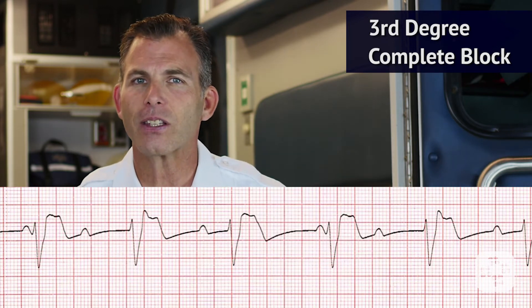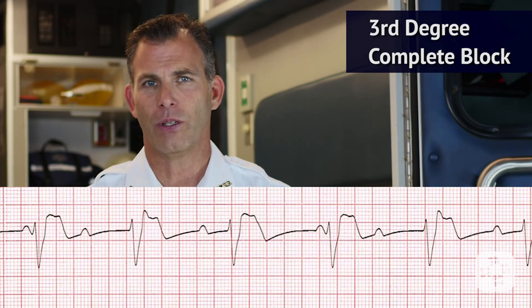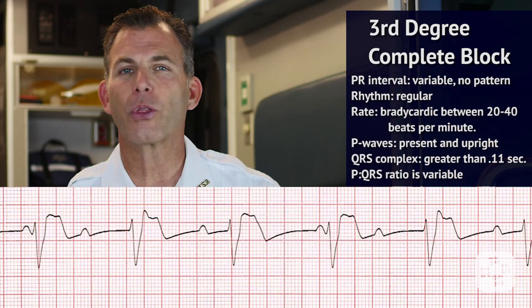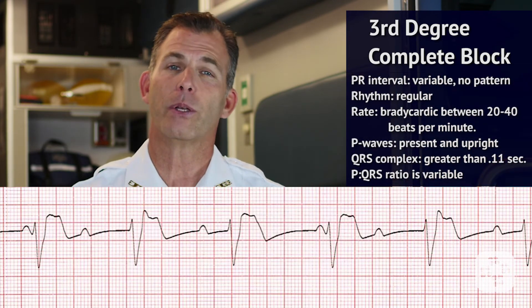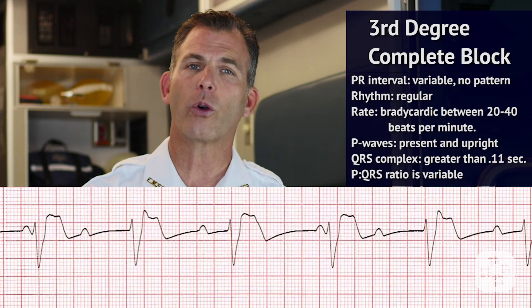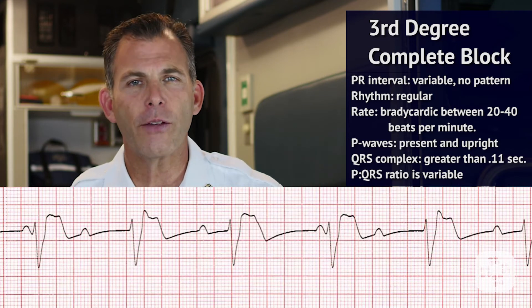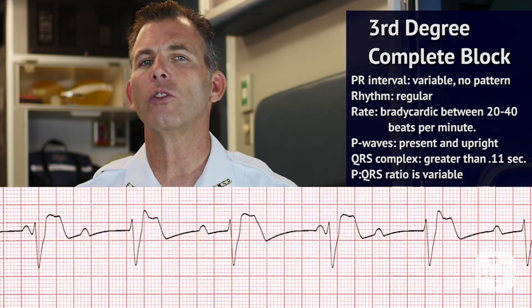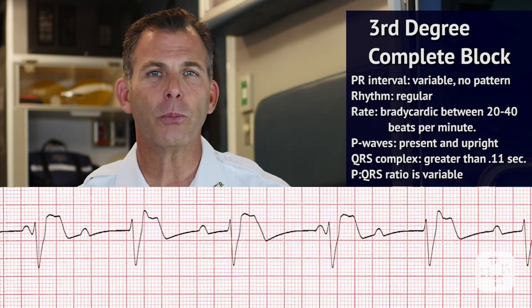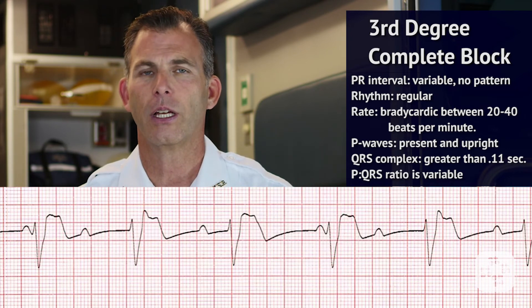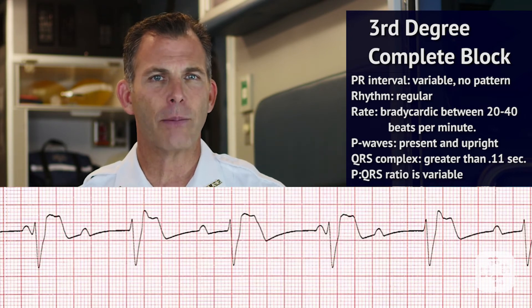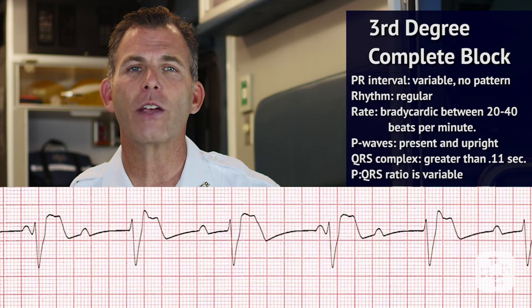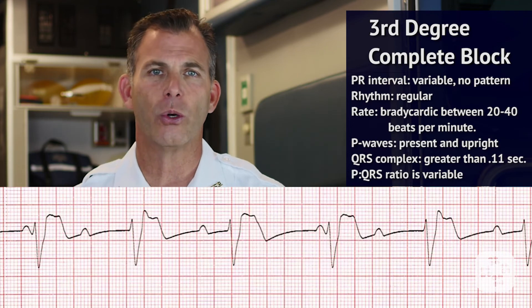In this case, the ECG is as follows. The rhythm is regular but the rate is bradycardic, between 20 to 40 beats per minute. P waves are present and upright while the P to R interval is variable with no real pattern. The QRS complex is greater than 0.11 seconds and the P wave to QRS ratio is variable.